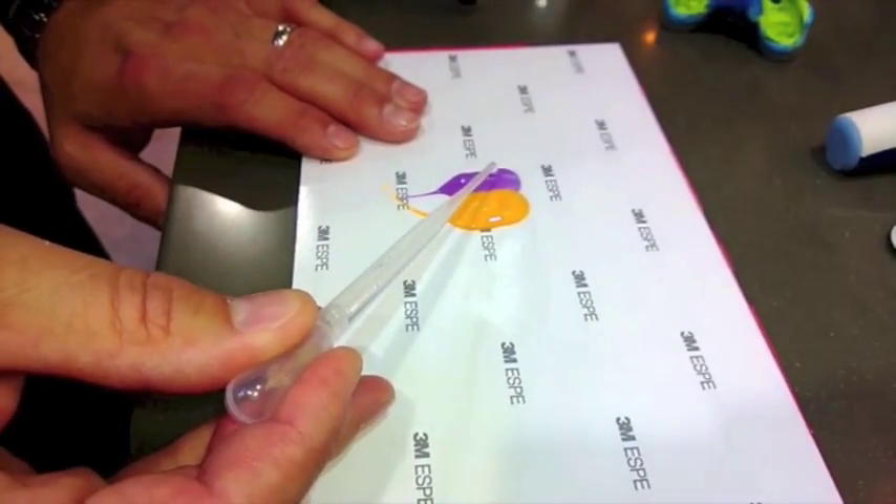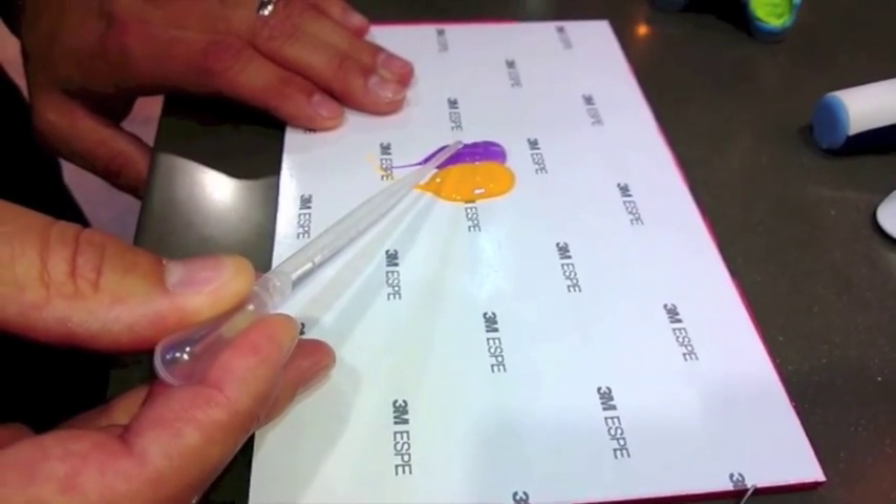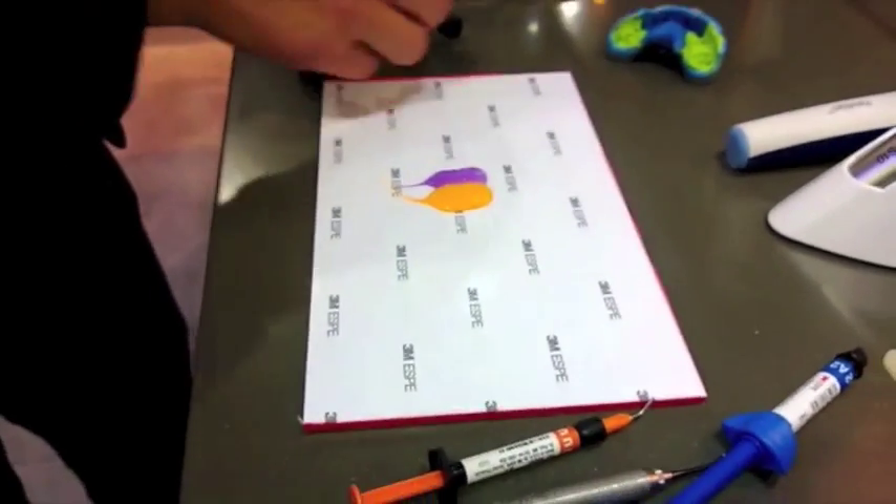When you drop it on the Imprint 4, it immediately just washes away, showing that it's more hydrophilic than the competitive materials.